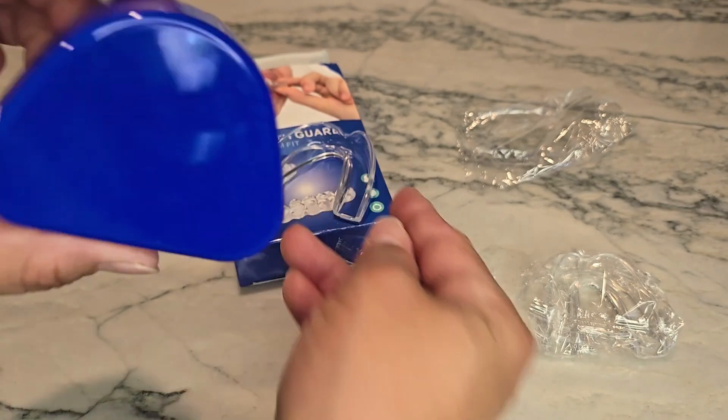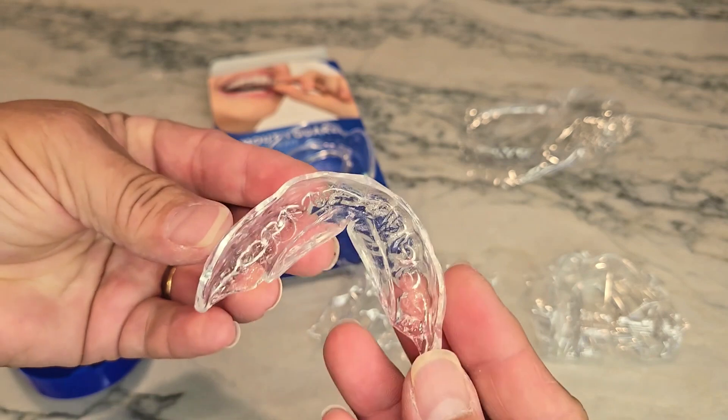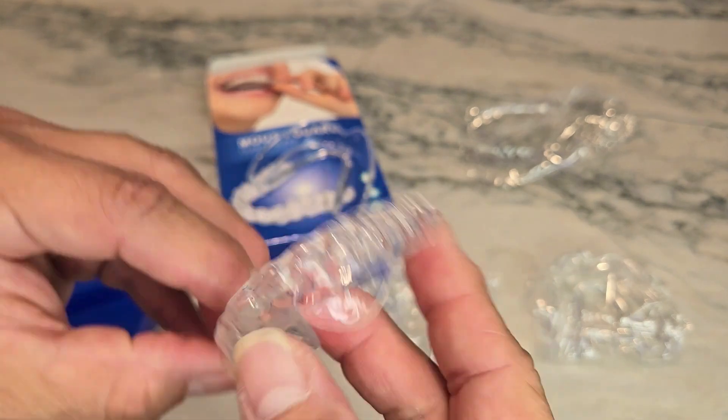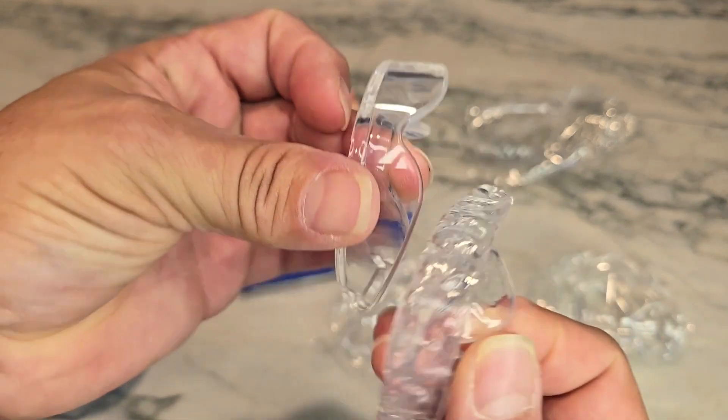It does come with a little case for you to keep yours in. I have already molded mine, and as you can see, mine is super duper thin as well as very short, because I didn't like how this was hitting under my lip.